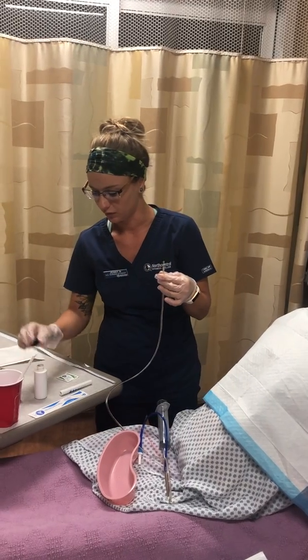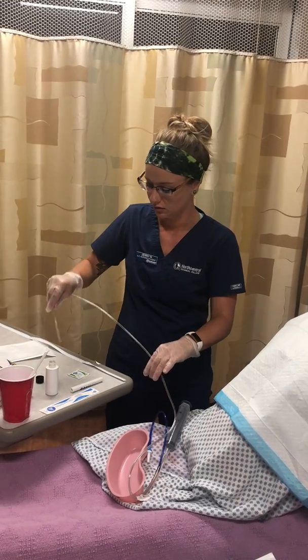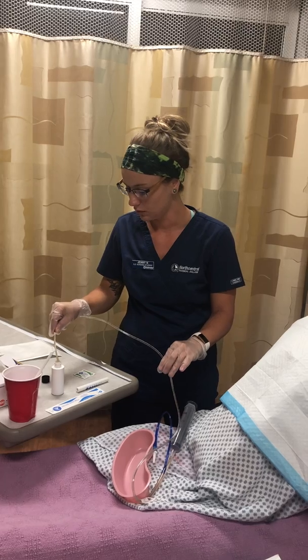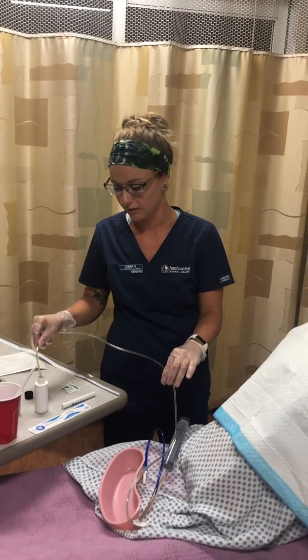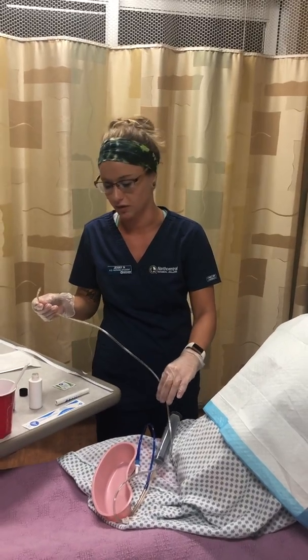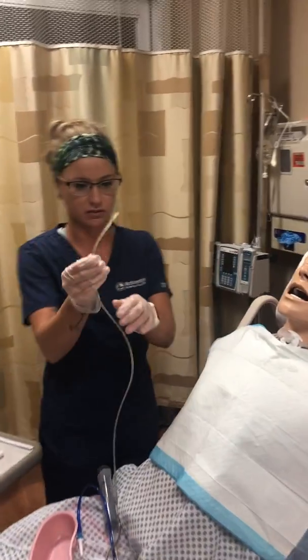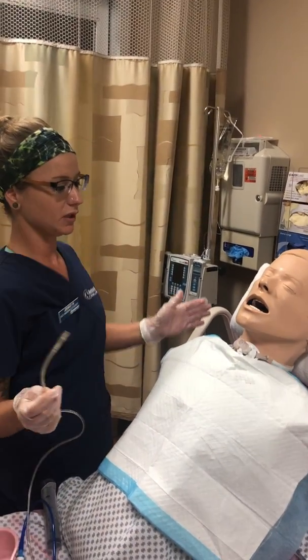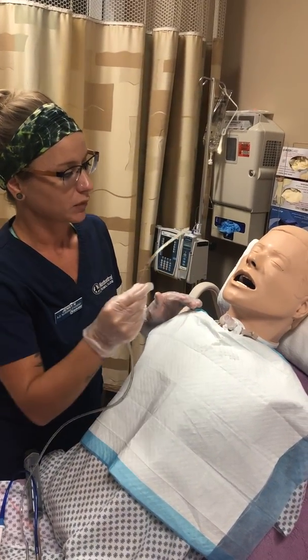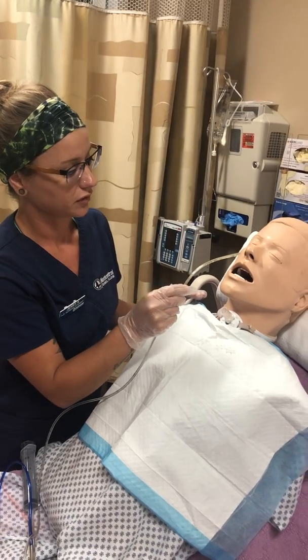And I'm going to open my lubricant. I will lubricate my tube. And you can have your patient hold on to a cup of water if they're able to swallow, if they want to drink and swallow to assist with the insertion. Okay, so I'm going to follow the natural curve of the tube.